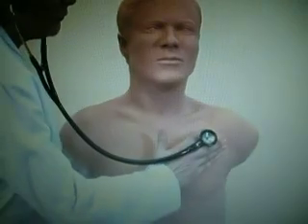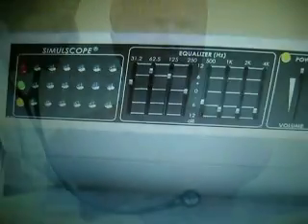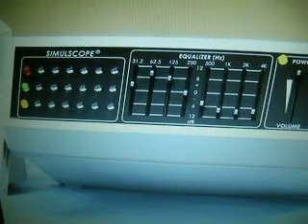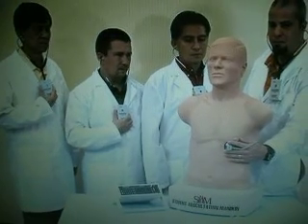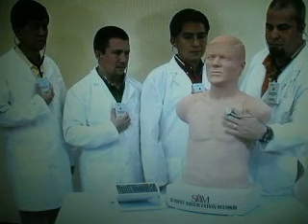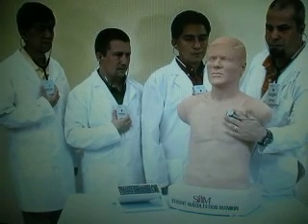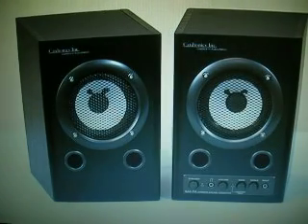Students listen to SAM with their own stethoscope. No special scope is needed. For classroom presentation, the Simulscope infrared auscultation system is ideal. The stethoscope is placed on SAM in the normal manner. Each student wears a wireless Hartmann infrared headphone. Everyone hears simultaneously with sounds that are very similar to a stethoscope. A speaker system is also available.